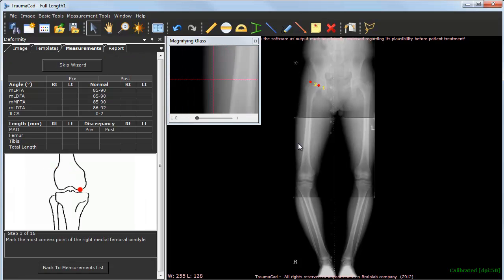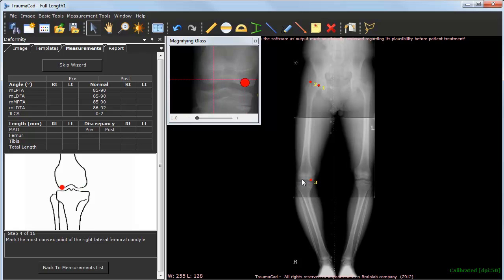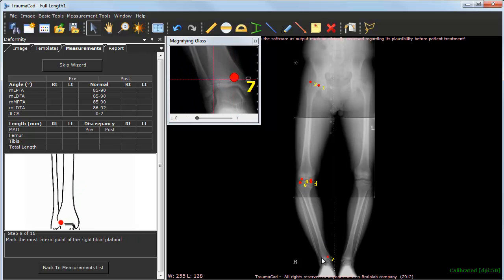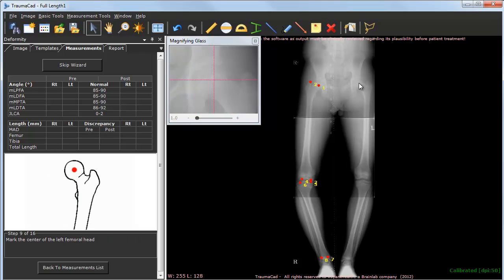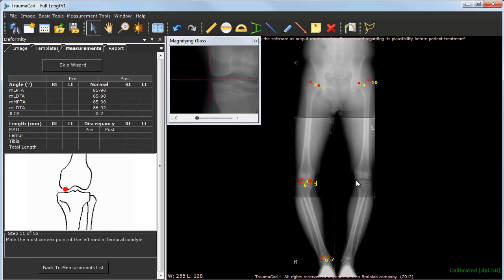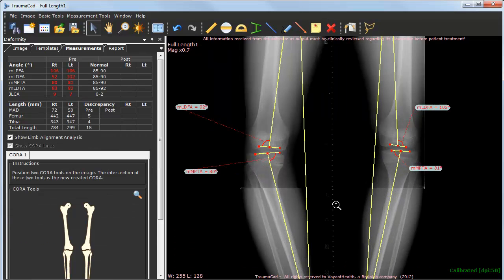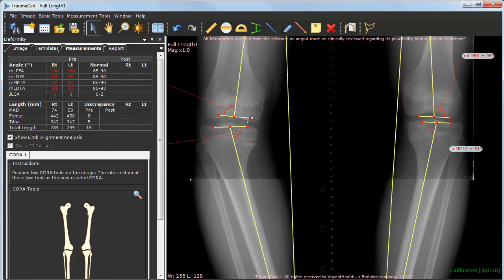The wizard guides you through the process of identifying anatomical landmarks by clicking them on the image. At any point, you may zoom in to adjust any of the markers.